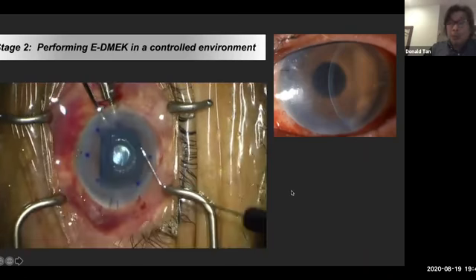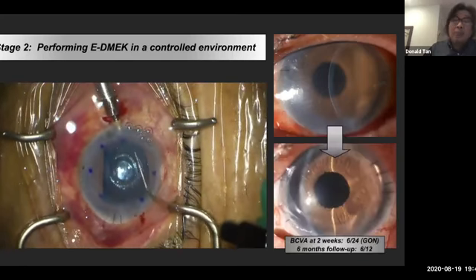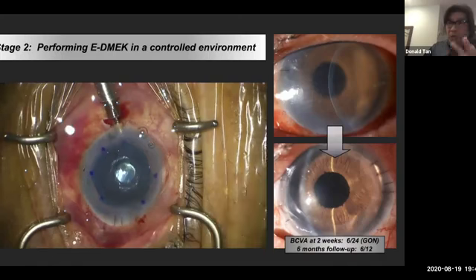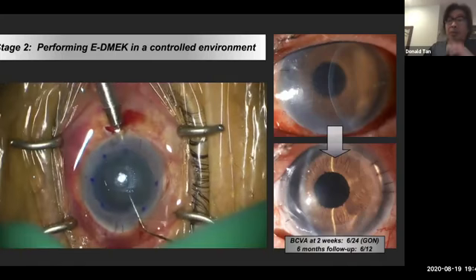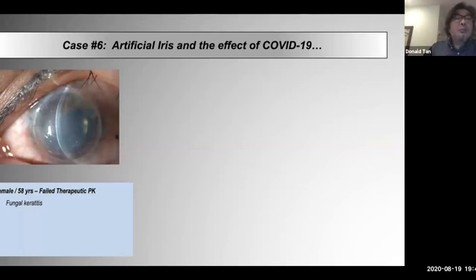There we go. So this patient did very well. He's got glaucomatous optic atrophy. So 6/24 is his best vision. We've got 6 months follow-up. So finally, my last case. This is what happens with COVID. Another bad case, fungal keratitis, therapeutic graft done, large graft, 270 degrees of PAS, secondary glaucoma.